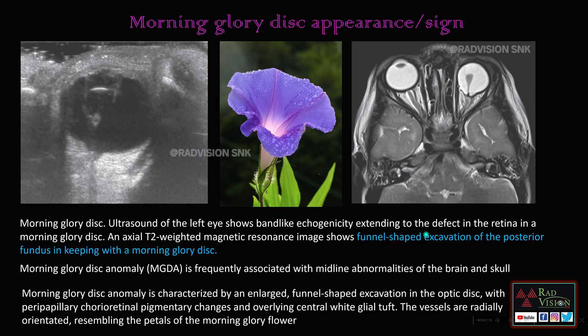Next, what is the morning glory disc appearance or sign? Here you can see an ultrasound of the left eye where there is band-like echogenicity extending to the defect in the retina, and on MRI you can typically see the funnel-shaped excavation of the posterior fundus. This funnel-shaped excavation mimics the morning glory disc. The morning glory disc anomaly is frequently associated with midline abnormalities of the brain and skull.